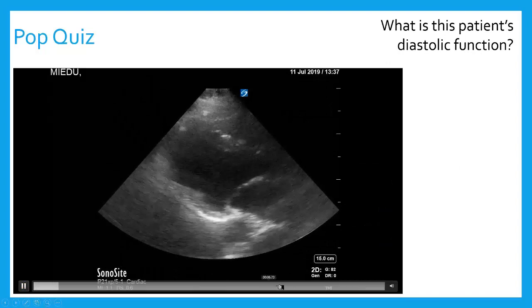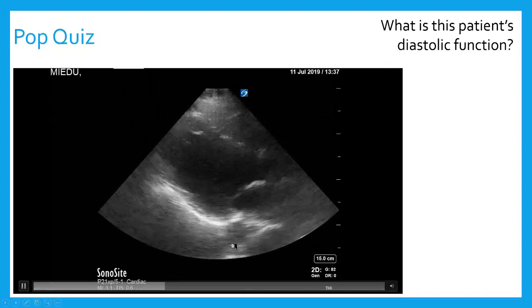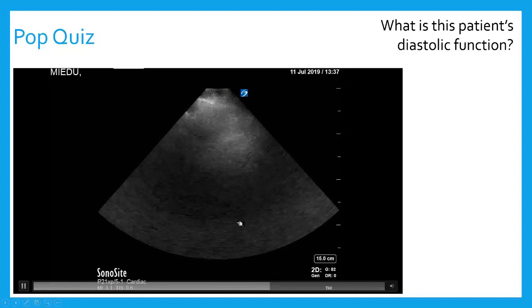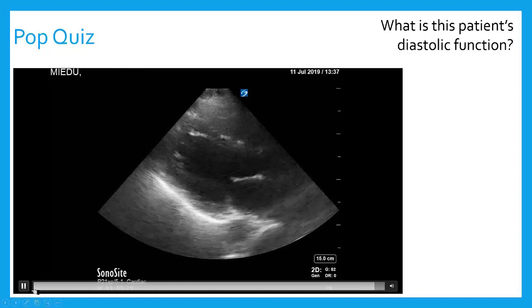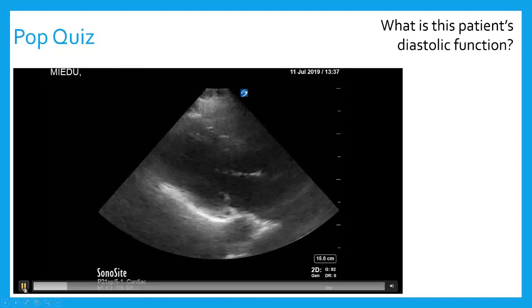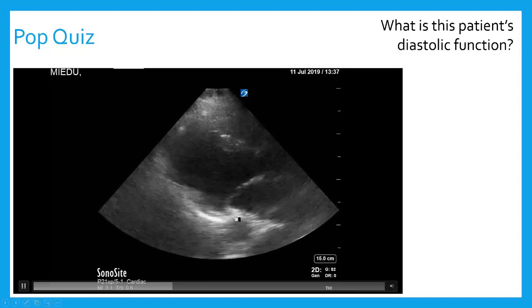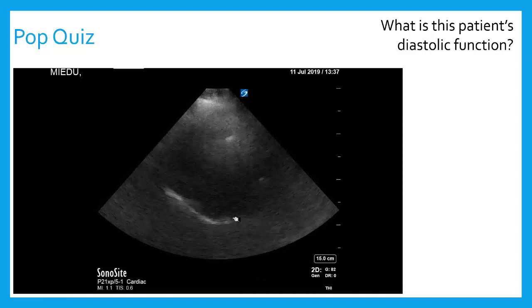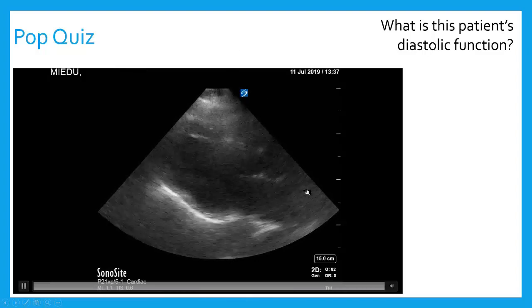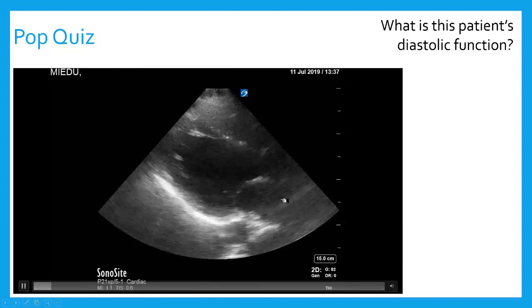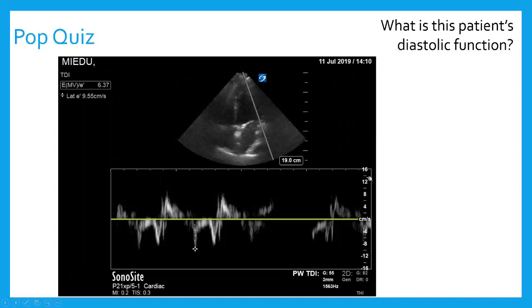How about this one — maybe a little tougher. Not everybody has great windows. From this parasternal long axis, can I say anything about diastolic function? For this patient, probably not definitively. You can see some movement of the mitral annulus — the myocardium seems to be rocking back and forth — but I can't tell how fast that's going. It's not super vigorous, but it's not not moving like the last person's. So this one I have to throw tissue Doppler on. And I can see my lateral E-prime is right at the edge of normal — about 9, a little lowish. So there's probably some diastolic dysfunction, but that would have been difficult to pick up qualitatively. I have to do it quantitatively.